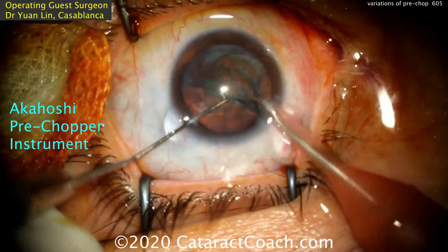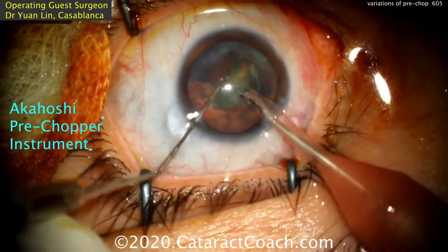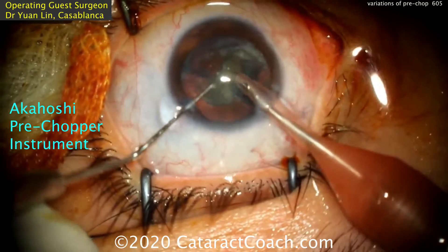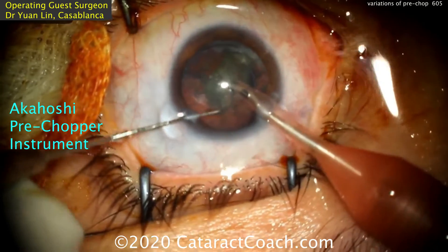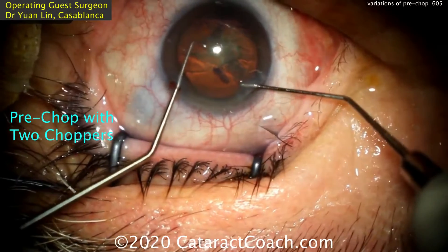The downside is it requires a special instrument, there's an extra step, and you have to do it under viscoelastic. So after you do hydrodissection, you may have to replenish the viscoelastic in the anterior chamber to keep it inflated. But the good part is very little energy.